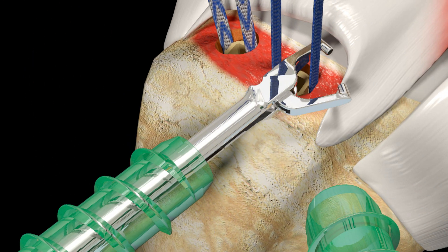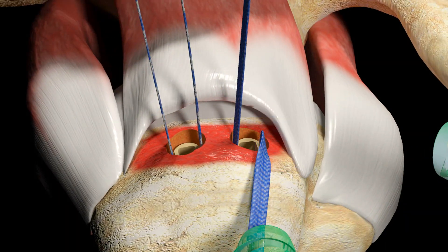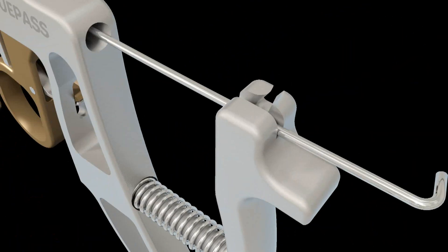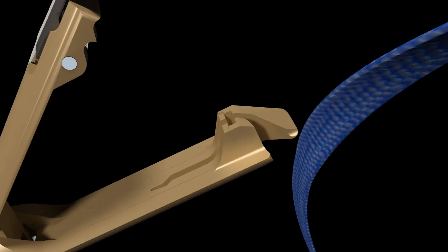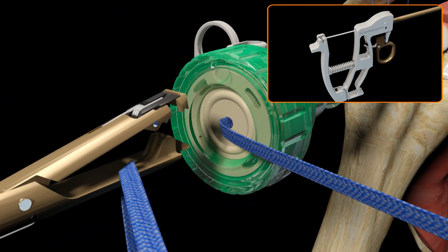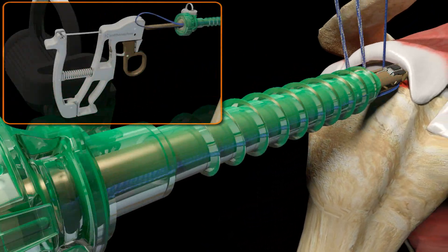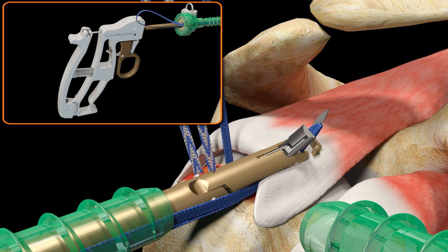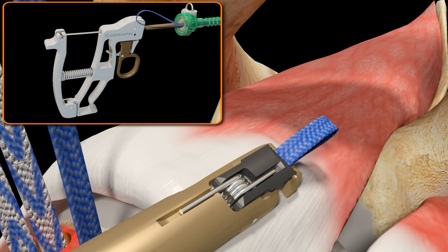Using a suture loop grasper, retrieve one limb of Ultra Tape from the anterior medial anchor and pull it out through the lateral cannula. Outside of the joint, load the limb of Ultra Tape into the lower jaw of the TruePass self-capture suture passer, close the jaws, and pass it down the lateral cannula. Position the jaws on the anterior medial aspect of the tendon and actuate the device by squeezing and releasing the rear handle to pass and retrieve the Ultra Tape in one motion.